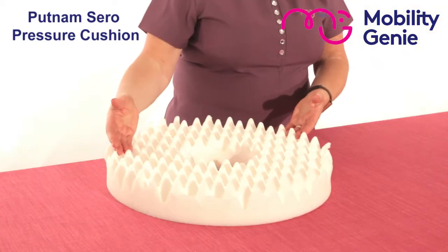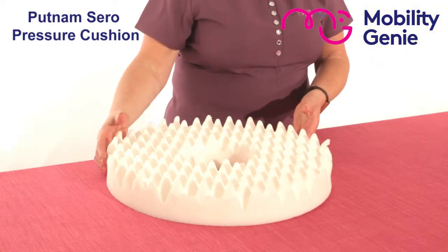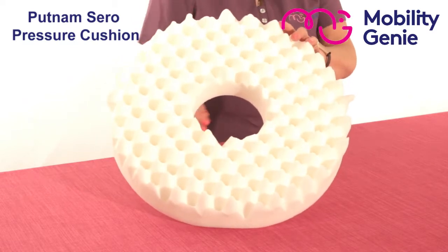This cushion is a ring cushion, otherwise known as a doughnut cushion. It's shaped in a circle and has a hole in the middle.